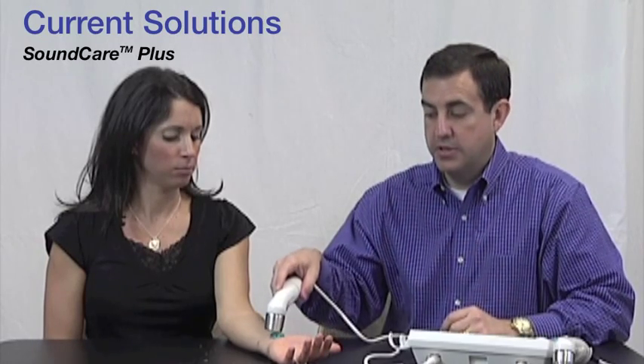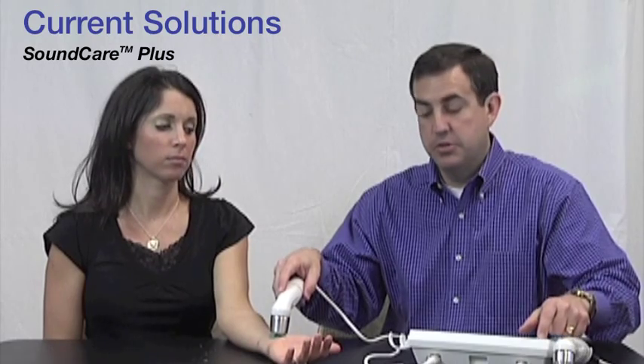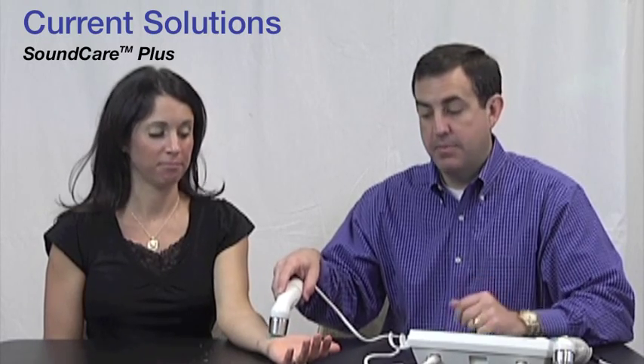I'm going to use the five centimeter sound head on this area — it's a nice large area. First, I'll make sure my power is going to this sound head, then go ahead and start, apply the sound head to the gel, and use my finger to turn it up. It tells me exactly how many watts per centimeter squared is going to the area. I picked my preset and I'm operating at one megahertz.